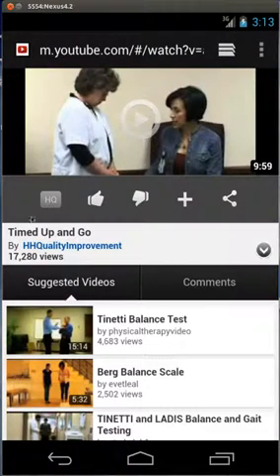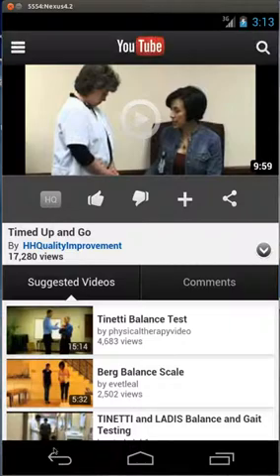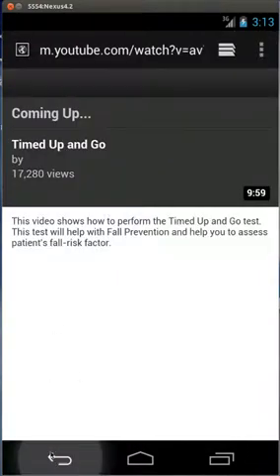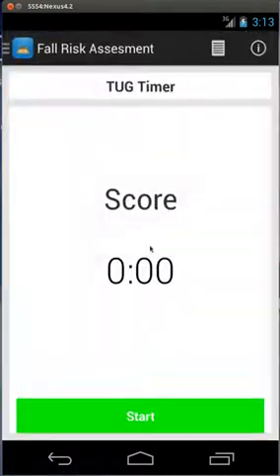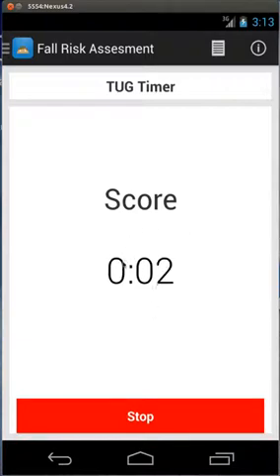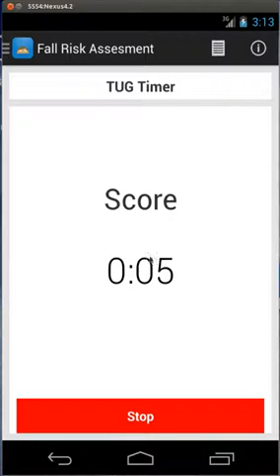So what happens is when you load up the app and you click start, this little timer is going to go and depending on the patient's time, it's going to determine the risk factor up here.